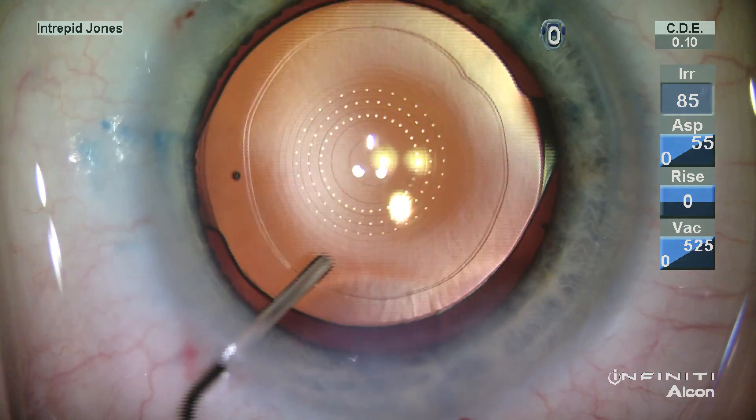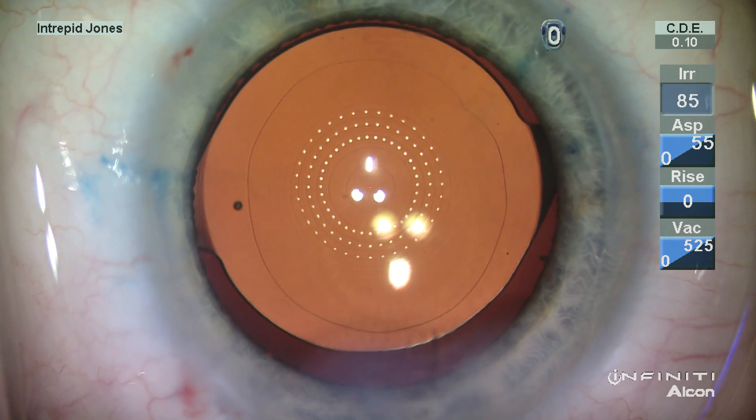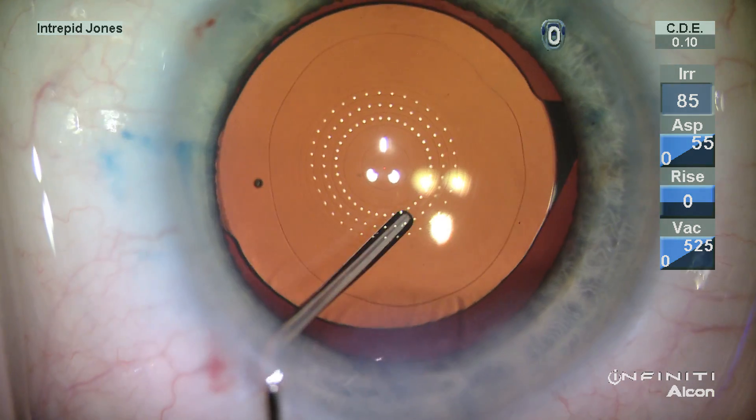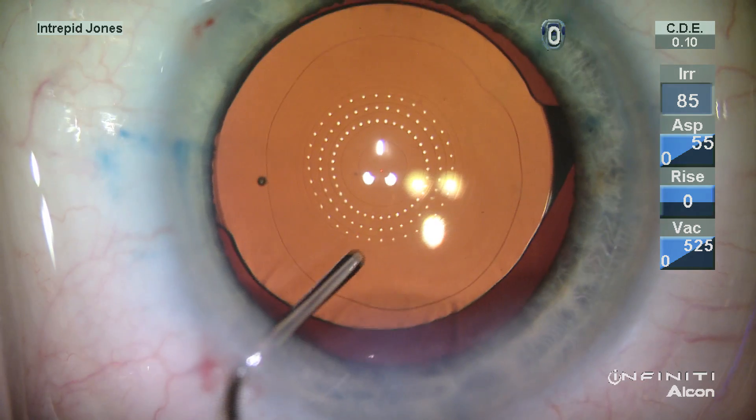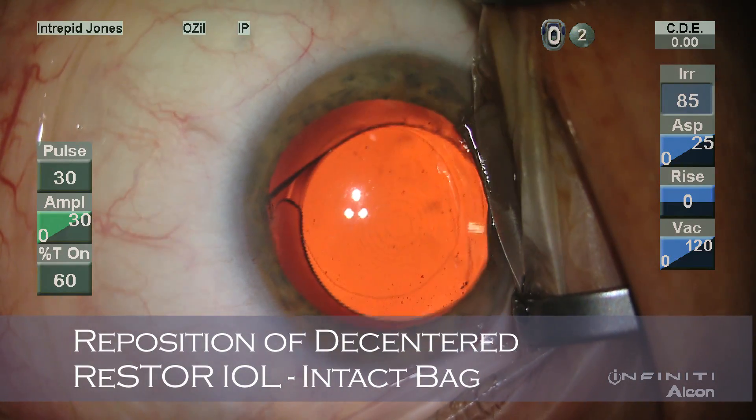At the conclusion of the case, you can use the keratoscopic rings and the concentric nature of the diffractive grating to create a very precise alignment of the lens to the visual axis.